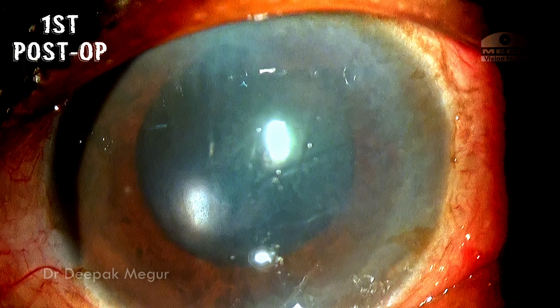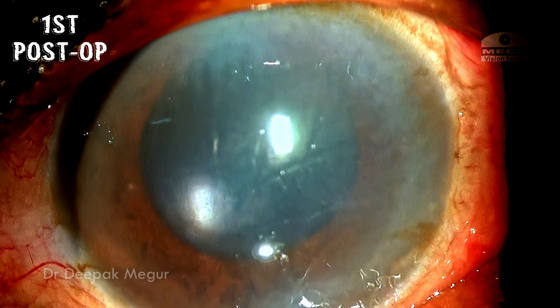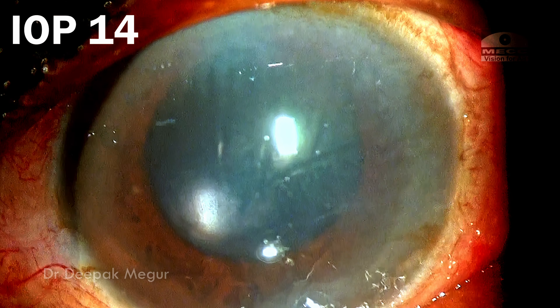These are the first day post-op pictures. There is some amount of corneal edema predominantly because of the pre-existing inflammation and raised intraocular pressure. But on the first day the pressures were normal, and eventually the patient did well.